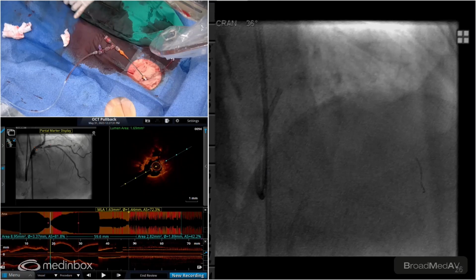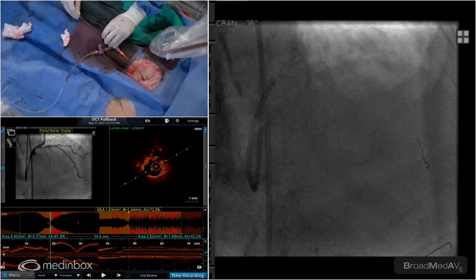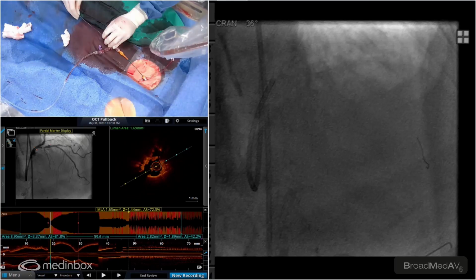You just pin the wire there for me. Yeah, I've got the wire. Just a little bit more tension for me. Keep pulling, keep pulling. I got it. Perfect. Let's test it. Let's make sure I didn't. All right. Okay, coming on. Perfect. 161. We'll accept it. Glide is dripping. Okay.